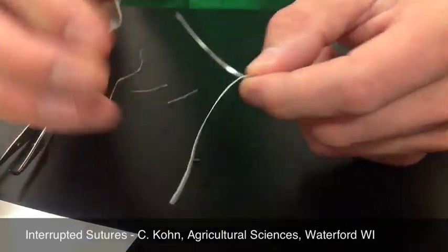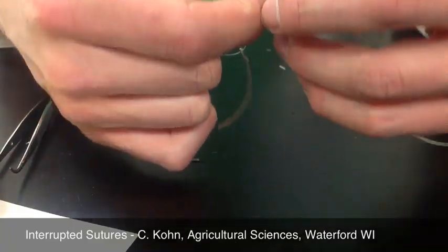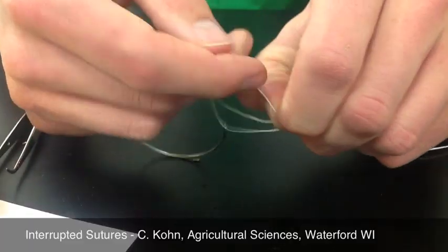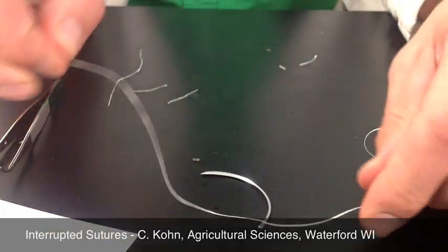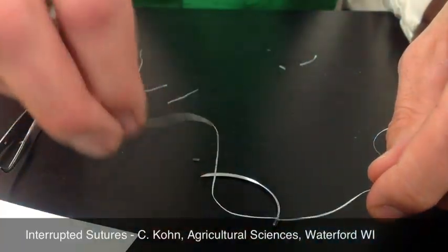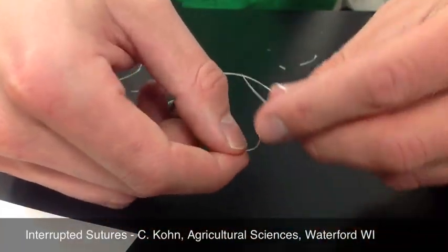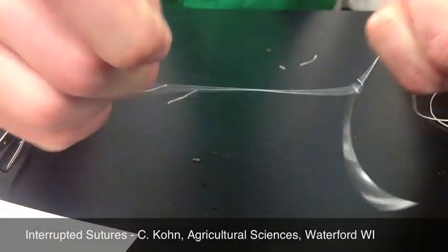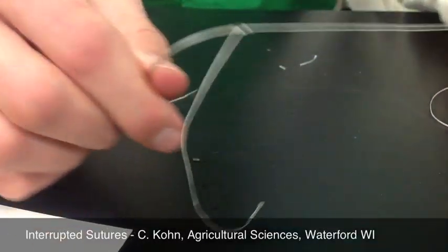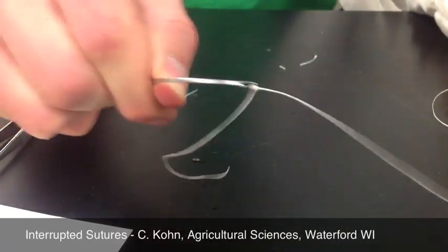And you're going to tie a square knot. To tie a square knot, what I like to do is go behind and around first, and do a slip knot like so, and then pull it tight. And because I went behind the first time, I'm going to go in front the second time and around. So I'm going around like so, I'm going to pull it off, and you just want to check to make sure you got it right. If it's a square knot, when I pull, it shouldn't shift at all — and you can see that's the case here.